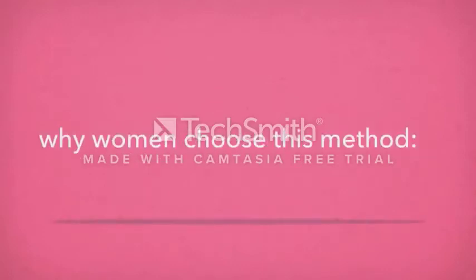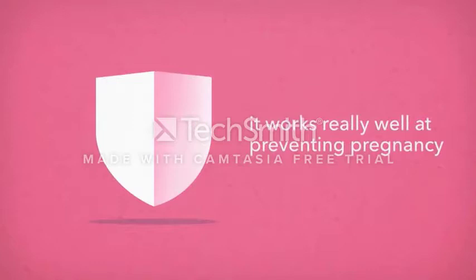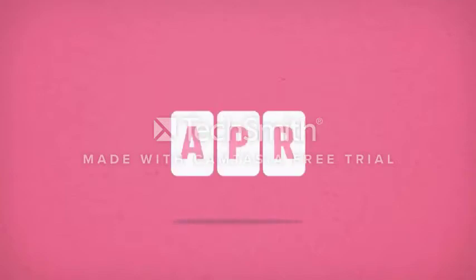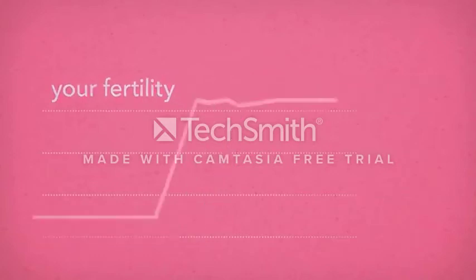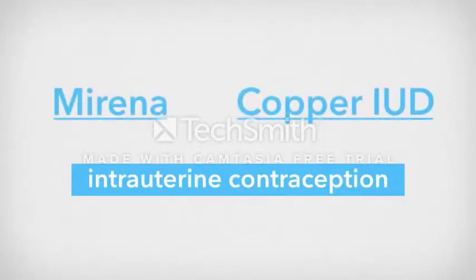There are many reasons why women choose this method. It works really well at preventing pregnancy. It doesn't interfere with sex. Once fitted, you can forget about contraception until the device is due to be changed. And once it is removed, your fertility goes straight back to what is normal for you. This film introduces the 2 types of intrauterine contraception available, the Mirena and the copper IUD.